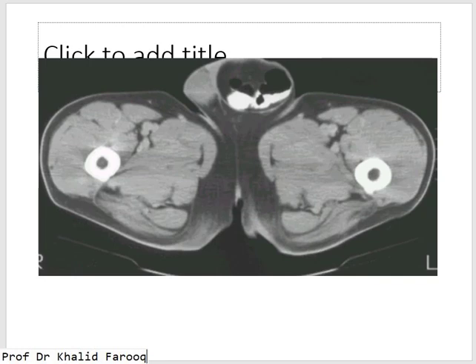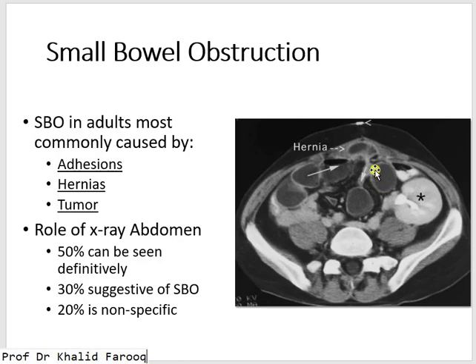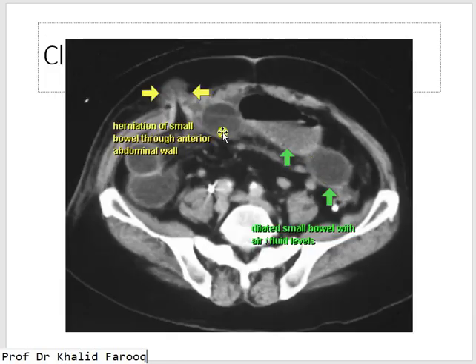These images show hernia through the inguinal scrotal region leading to intestinal obstruction. Another case shows hernia through the anterior abdominal wall — usually these are surgical hernias where, after a surgical procedure, the anterior abdominal wall becomes weak and gut loops can herniate through the weak portion. Another example shows hernia through a scar site in the anterior abdominal wall. The left kidney is a transplanted kidney; because of previous intervention there was a weak point, and herniated gut loops can be seen. Another example shows herniated small bowel through a scar site in the right lower anterior abdominal wall, with dilated gut loops proximal to this.